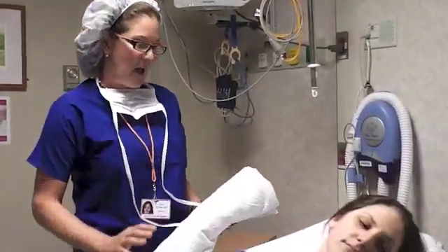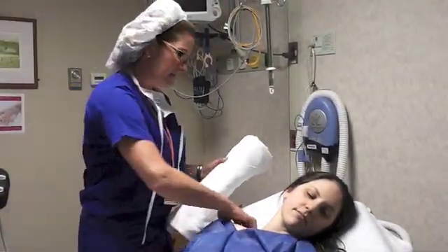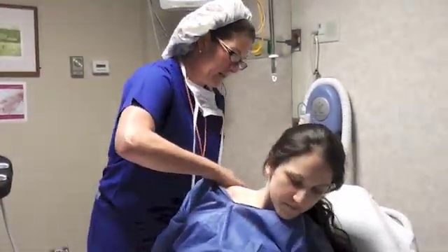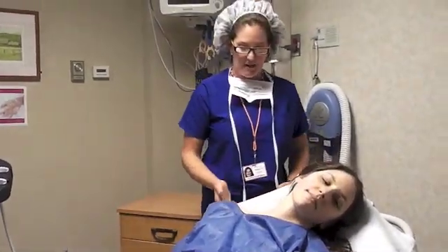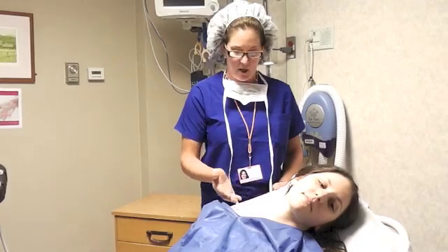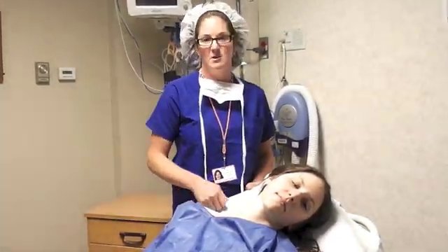This patient has been put on a stretcher in a semi-upright position. We typically use a folded blanket and/or towel to place beneath the scapula to optimize the distance between the stretcher and the needle insertion site. As you can see, we now have a much more open space in which to prep and drape and to place our needle.